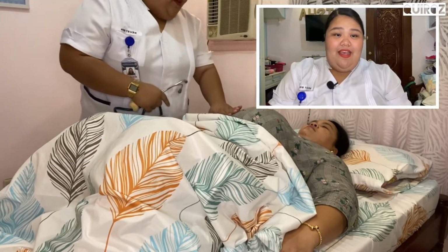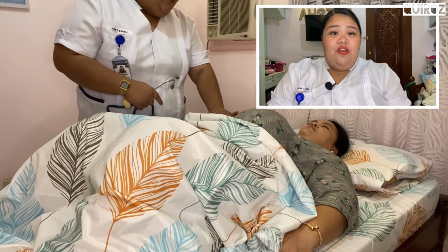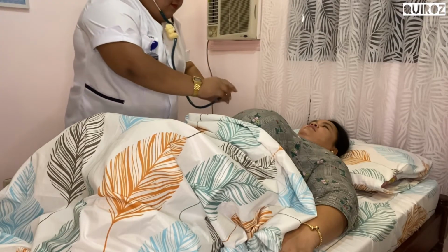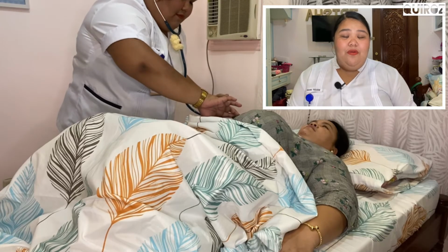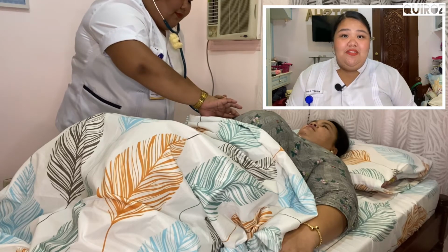Place the bell side of the stethoscope chest piece on the fetus' convex portion closest to the uterine wall. Listen by pressing firmly and yet very gently. Count for a full minute by holding the stethoscope chest piece while the other hand feels for the client's radial pulse.